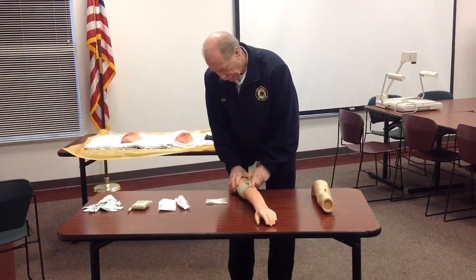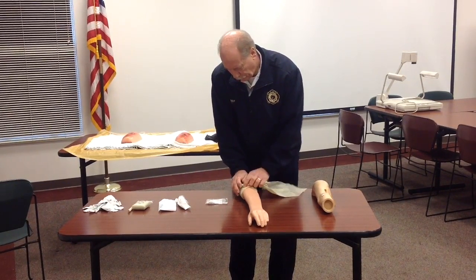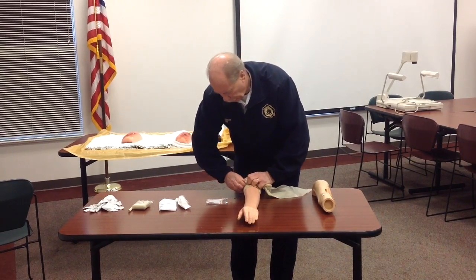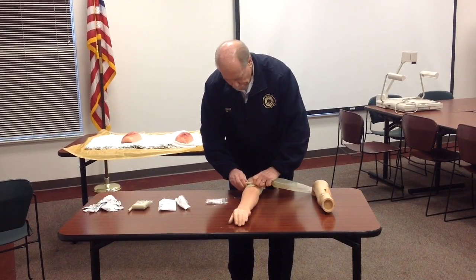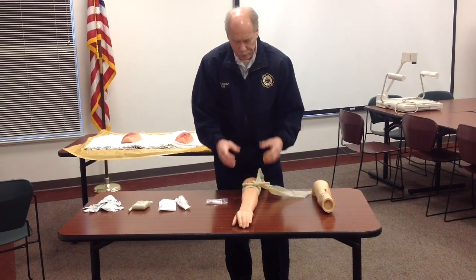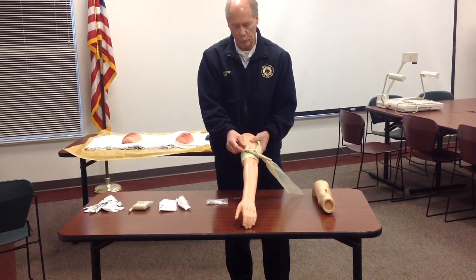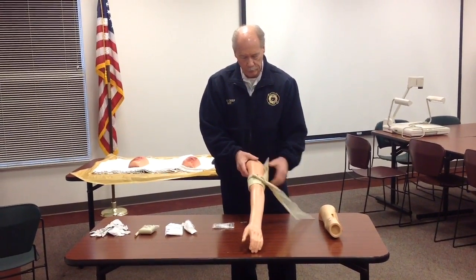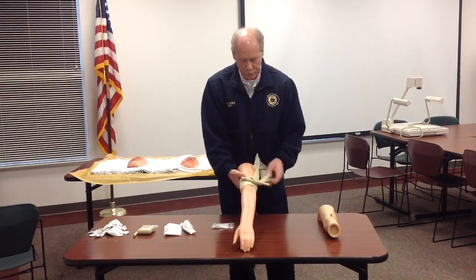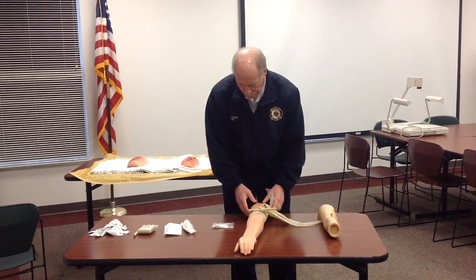Then use the dowel rod to tighten it, taking as many turns as you can. Note that on this mannequin it's fairly rigid, unlike a real arm where you'd be able to take several turns. Get it as tight as possible so that the bleeding stops. Then slide the ring up and over the dowel rod — that locks it in place. It's much easier than trying to tie the dowel rod down.